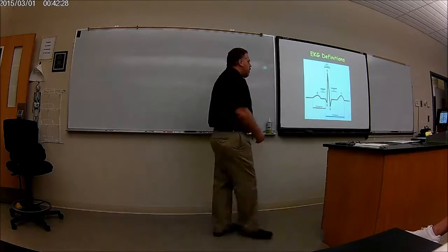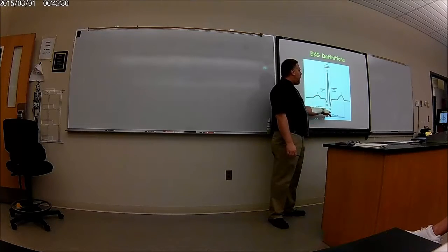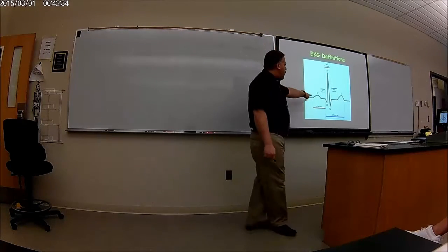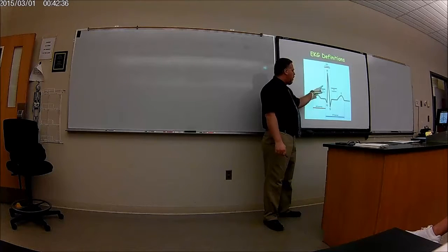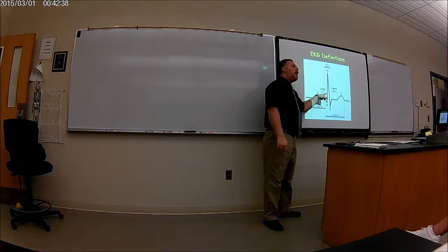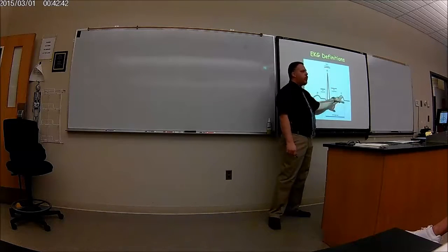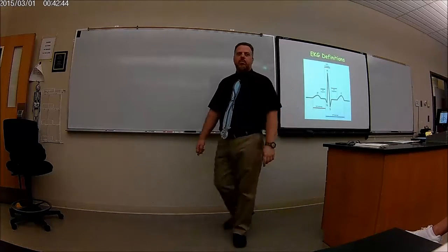So again, P, QRS, T. Atrial contraction, ventricular contraction with atrial relaxation hidden here, and that's ventricular relaxation. Okay?